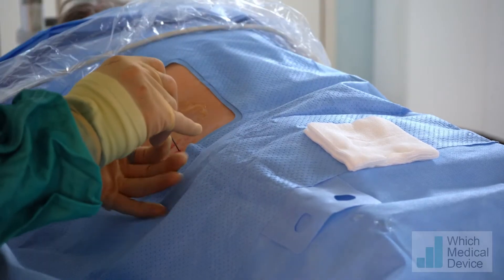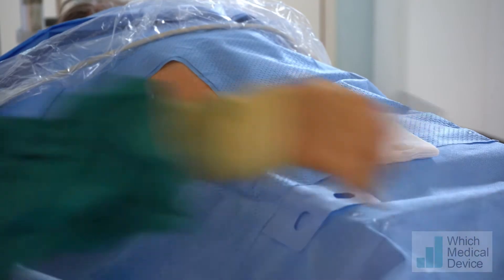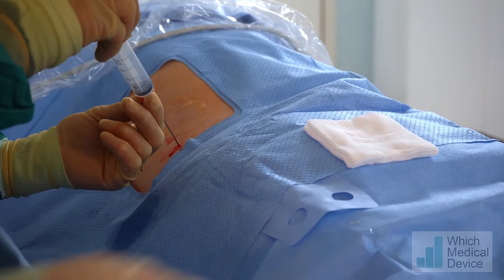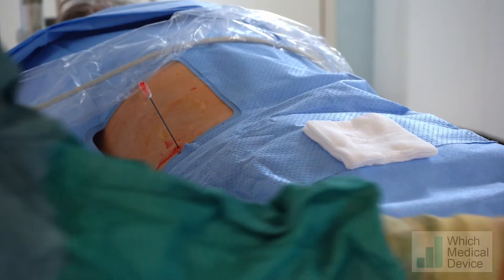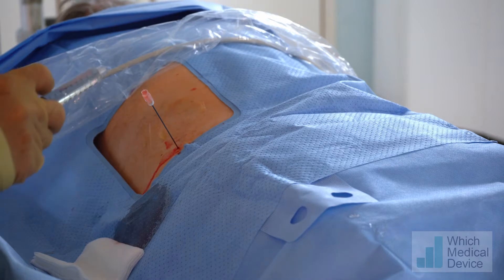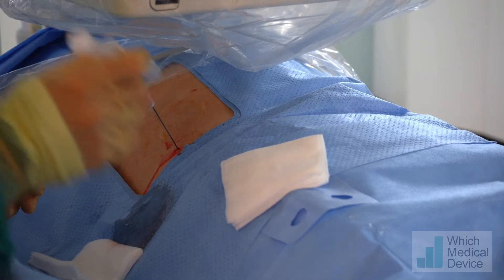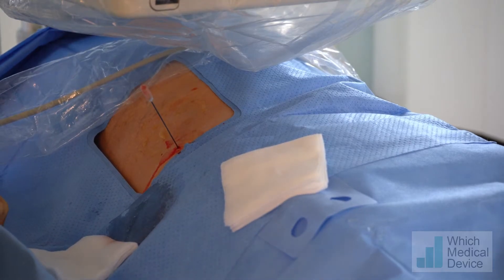We're just into the edge of that calyx and we've got some urine coming out. The first thing we need to do is decompress the system — we have an empty 20 ml syringe and we're just going to aspirate. We'll then pop some neat contrast in. I use neat contrast because the system is already dilated and it's going to dilute the contrast as soon as I inject it, so I want to put the minimum amount in.